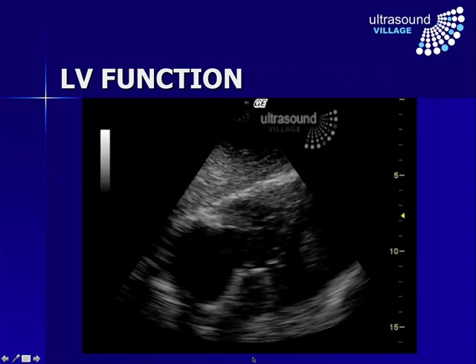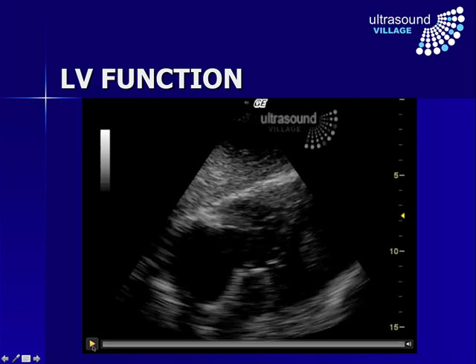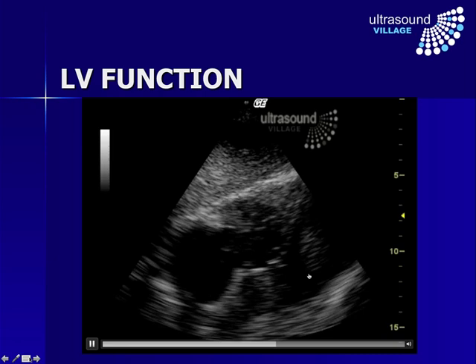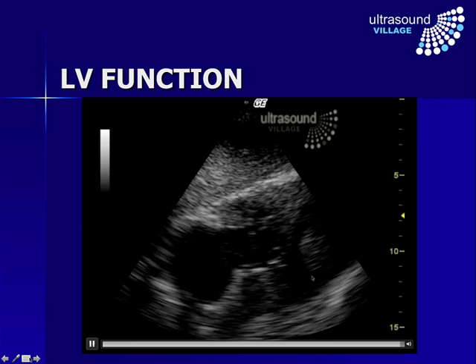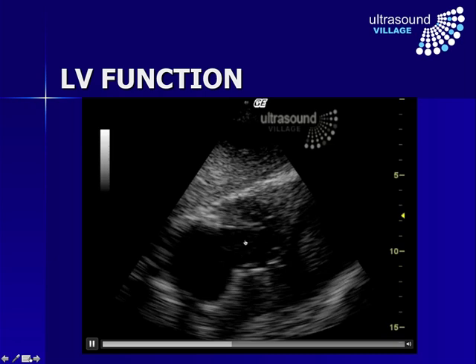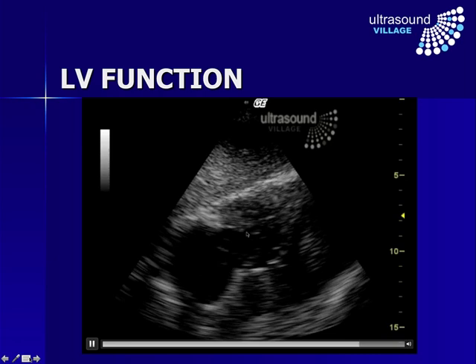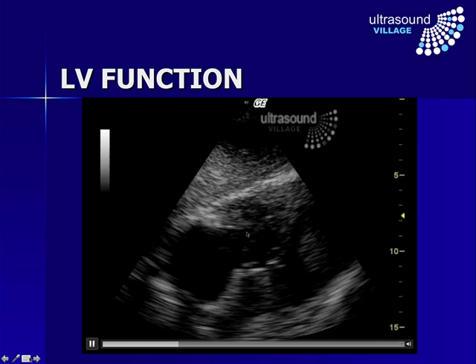Let's have some examples. Here is a subcostal view. The first thing we can note is that this is an akinetic heart. Here's the right ventricle, the left ventricle here, and there is virtually no movement whatsoever. We can see a little bit of flotation of the tricuspid valve leaflets just flapping back and forth a very small amount. But this is an akinetic heart.